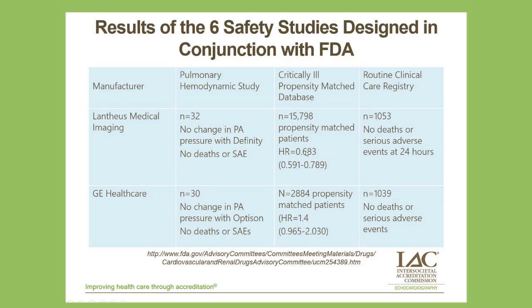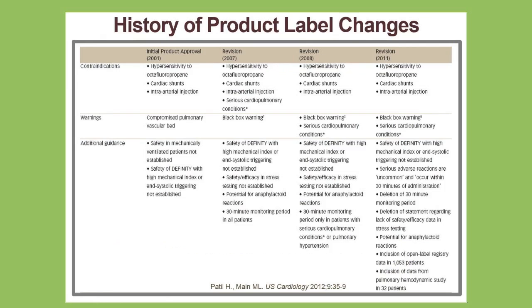In fact, in the LMI study, the Lantheus Medical Imaging arm, the point estimate and fairly narrow confidence intervals actually favored administration of contrast. And then in the routine clinical care registry of about 1,000 patients each, there were no deaths, no serious adverse events.